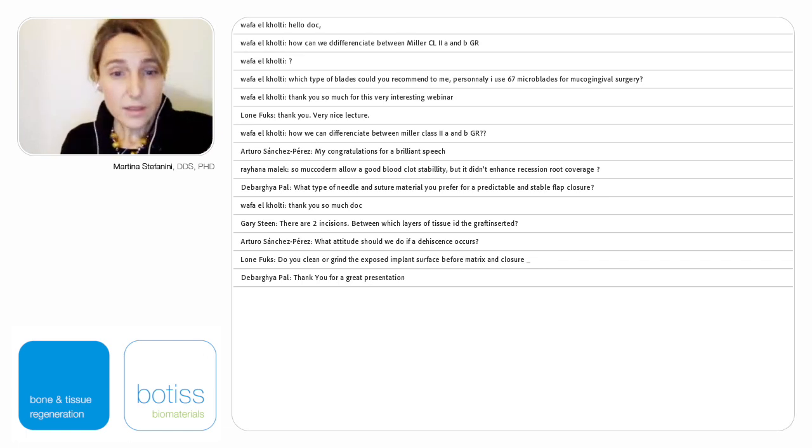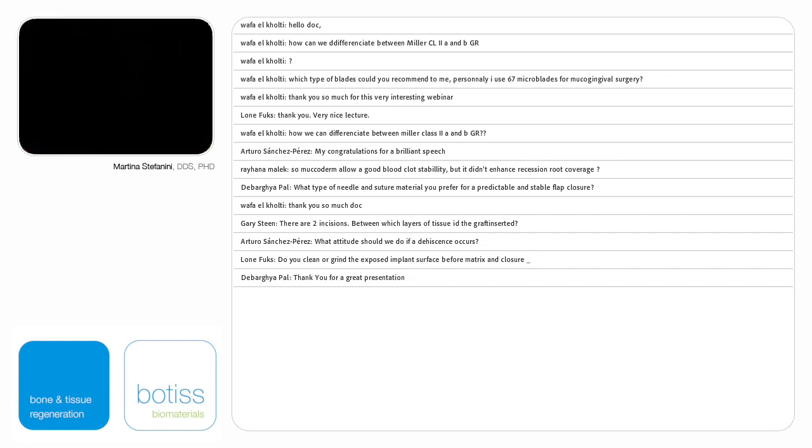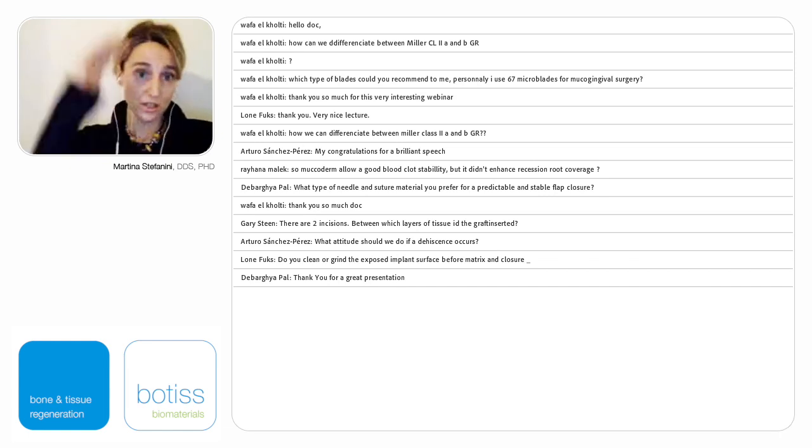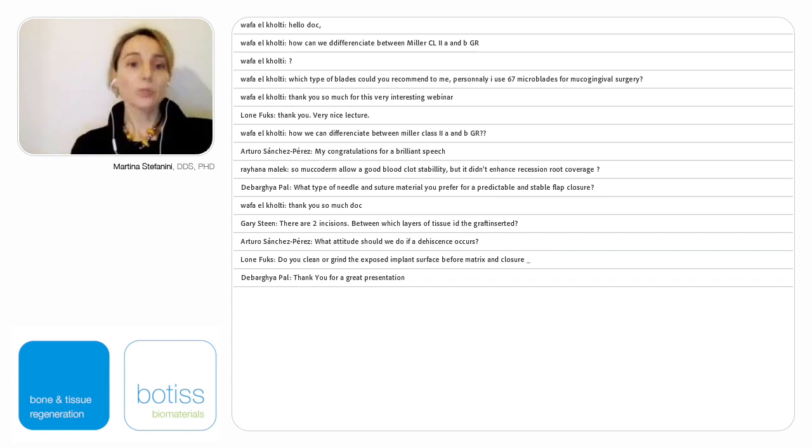Another question is, which is my attitude if I have to treat soft tissue dehiscence around implants. Maybe in another webinar, or if we have the occasion to see each other at a congress, I will tell you my combined prosthetic and surgical approach, that consists of a pre-surgical prosthetic approach plus a bilaminar technique with a trapezoidal shape flap design plus connective tissue graft in the treatment of apico-coronal soft tissue dehiscence around implants.